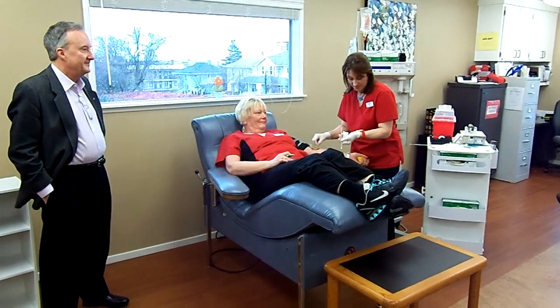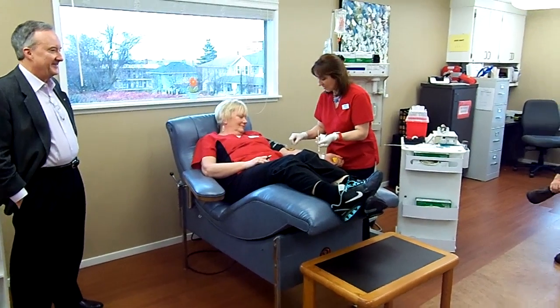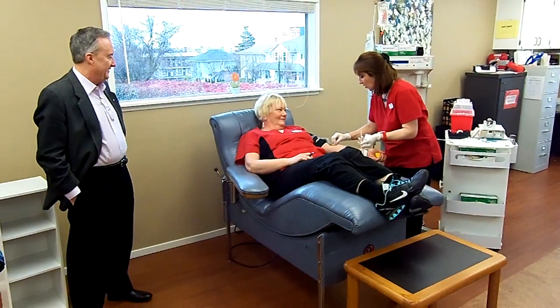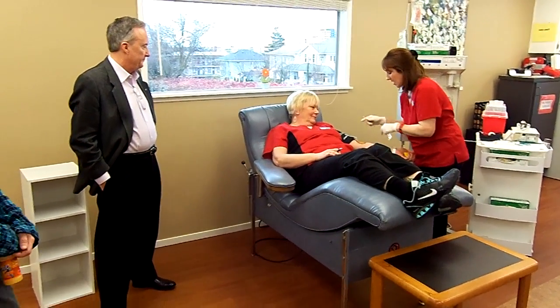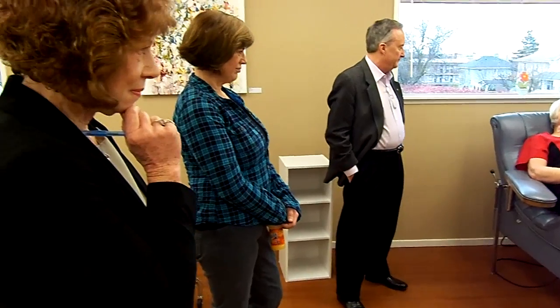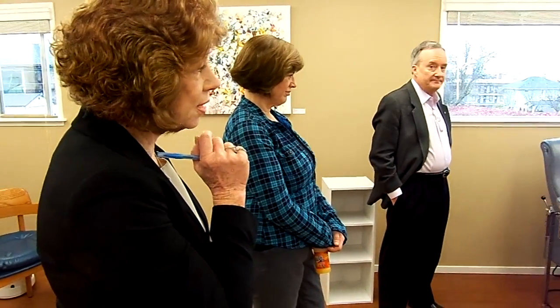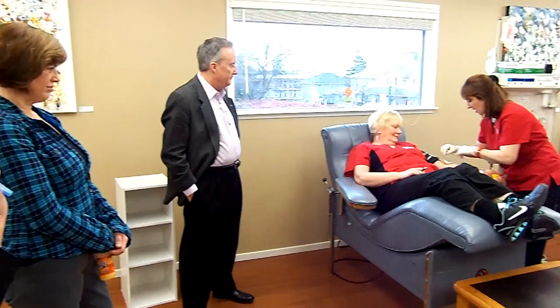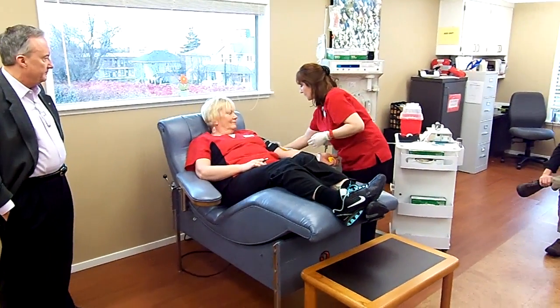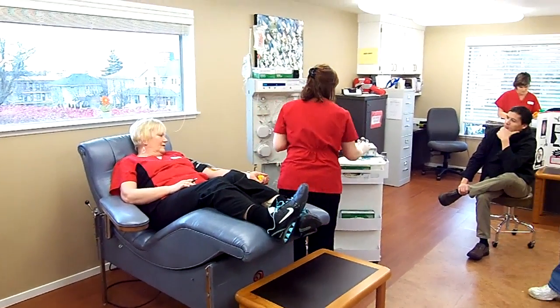Not 29, but you can go 31. You can go over 30 if you like, just one or two, but you really want to make sure that it's exact, and then you want to get any extra. You see how she's taking iodine off? You have to go from the center all the way out using sterile technique. You want to immediately cover that area before you begin.